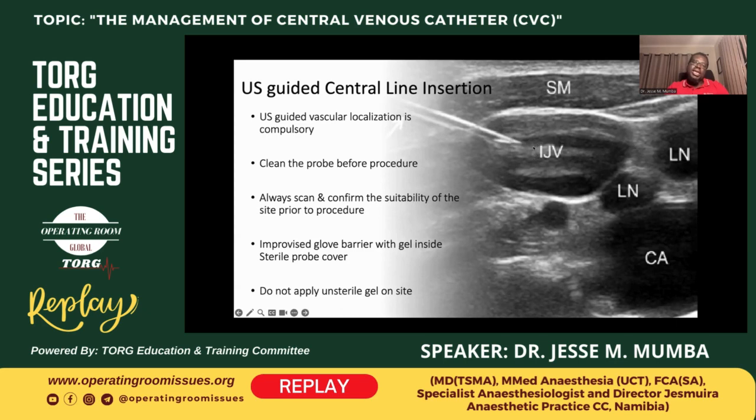And you can see clearly your needle coming in, and when you thread in your guide wire, you can also see it. The other thing that we normally do, after you place in your guide wire in this cross-section view, you want to look at the longitudinal view. So you're looking at the vessel in its longitudinal form. So you can see the whole guide wire running through and within the vessel, the lumen of the vessel.